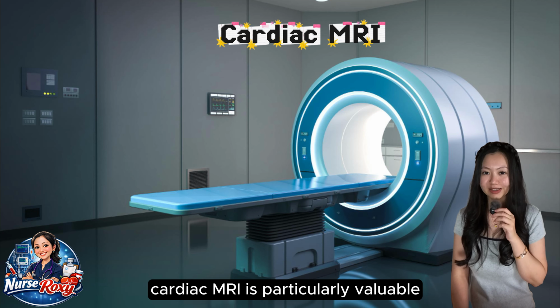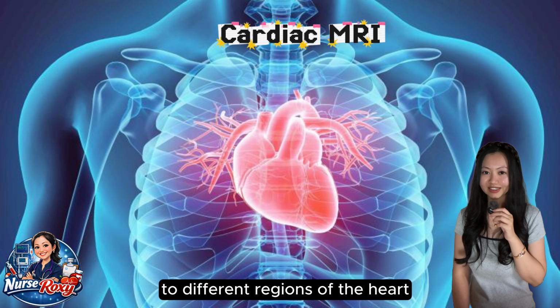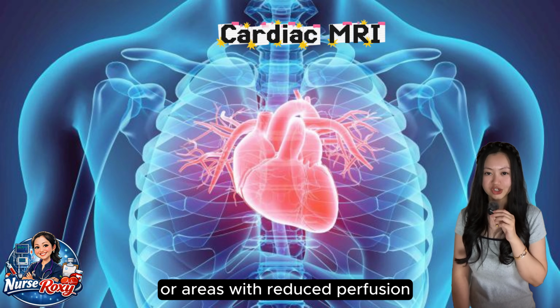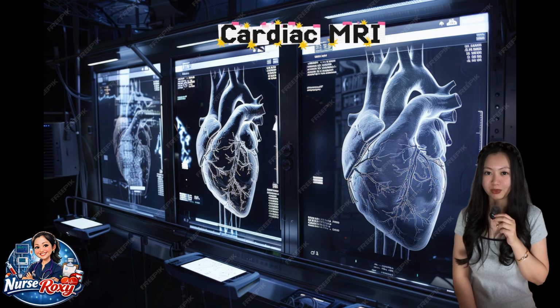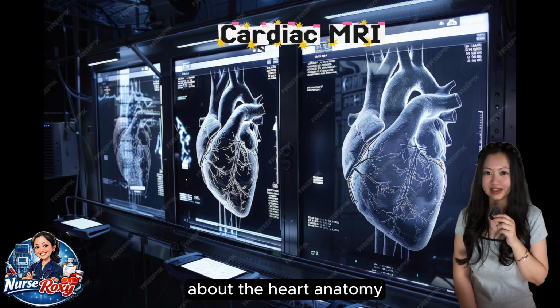Cardiac MRI is particularly valuable for assessing heart muscle damage. With contrast dye, it can show blood flow to different regions of the heart and identify scarring or areas with reduced perfusion. MRI also provides detailed information about heart anatomy, including the valves, chambers, tissue characteristics, and pumping function.